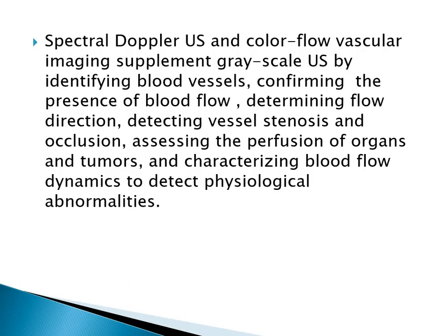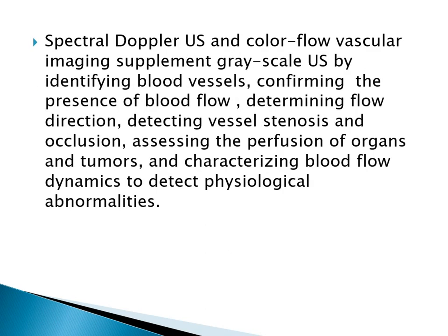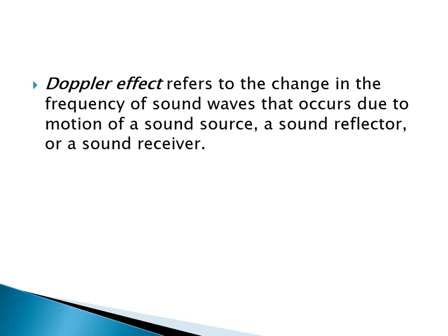Good morning everyone. Today's topic is about vascular ultrasound: spectral Doppler ultrasound and color flow imaging. They supplement grayscale ultrasound by identifying blood vessels, confirming the presence of blood flow, determining flow direction, detecting vessel stenosis, occlusion, assessing the perfusion of organs and tumors, and characterization of blood flow dynamics to detect physiological abnormality.